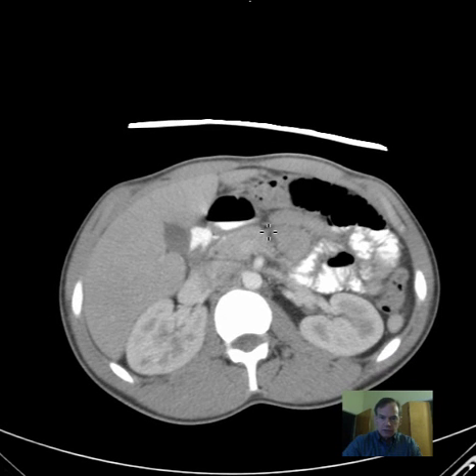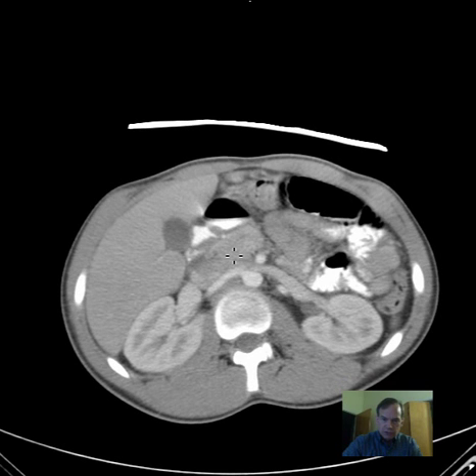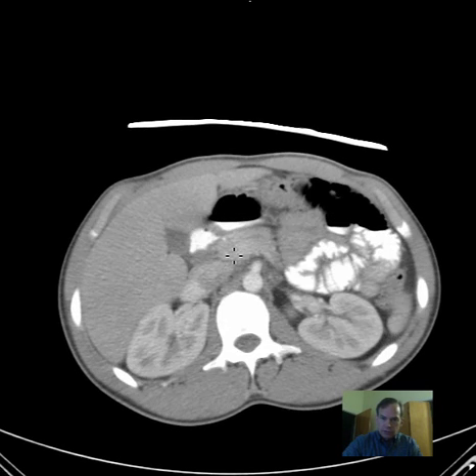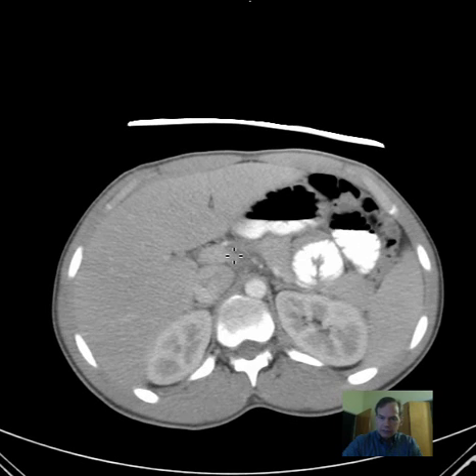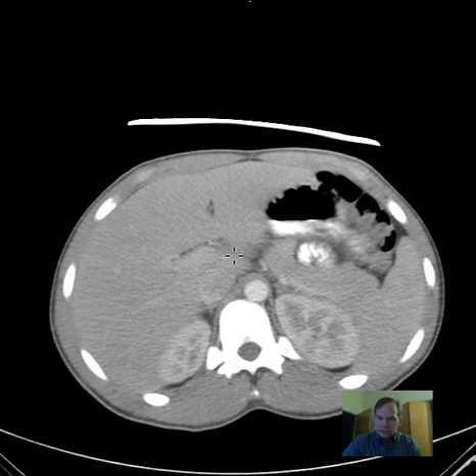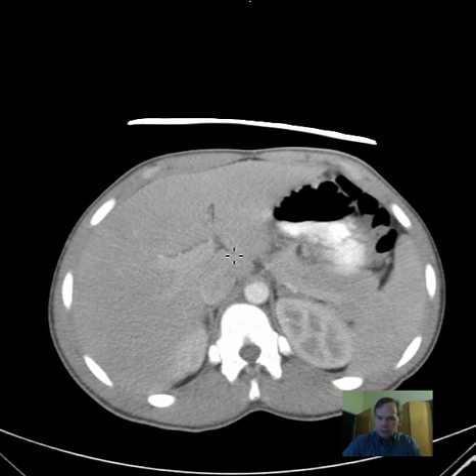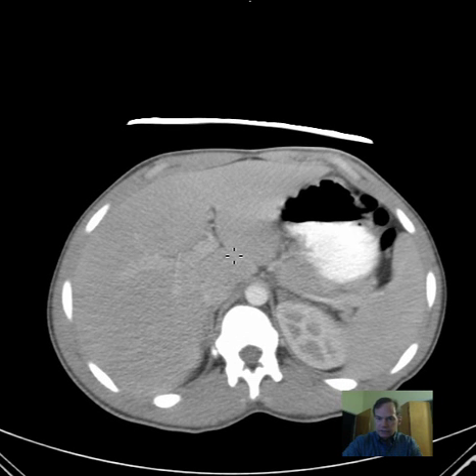Here you can see the pancreatic head is a little bit more inferiorly positioned compared with the pancreatic tail. That's typical but not always the case.